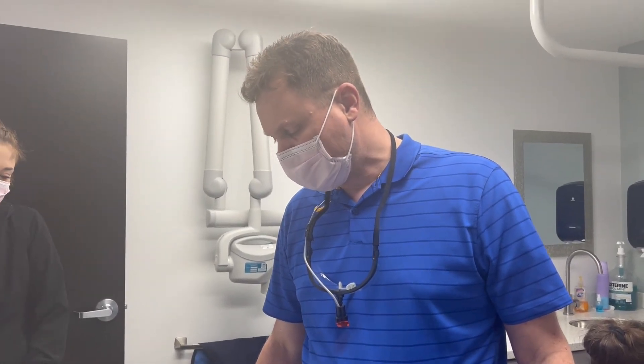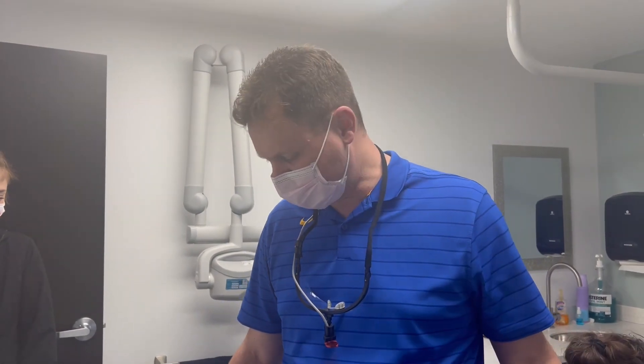Today we have an amazing patient who I delivered a denture to. She has two lower mini implants — and the same process applies for regular implants. I delivered the denture to her and then let her go for about a week to get rid of all sore spots. Now we're going to put on the locators. For mini implants it's locators with little O-rings; with regular implants it's little plastic-type rings. This procedure is called the precision attachment.